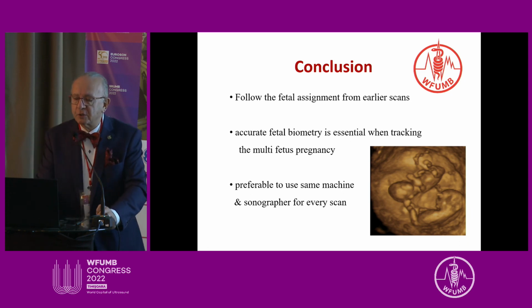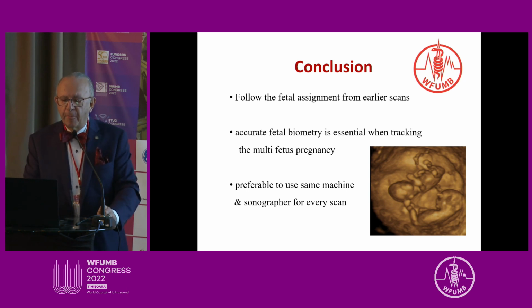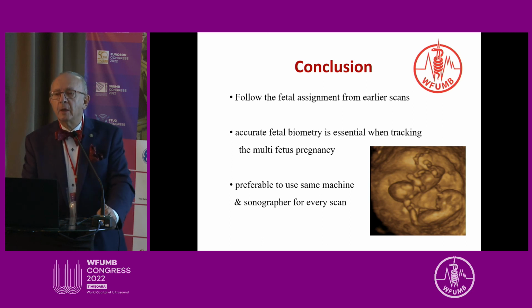So in conclusion, follow the fetal assignment from early scan. Accurate biometry is extremely important when tracking the multi-fetus pregnancy. It is better to use the same machine and the same sonographer, technician, or physician for every scan, although obviously this is not always possible.